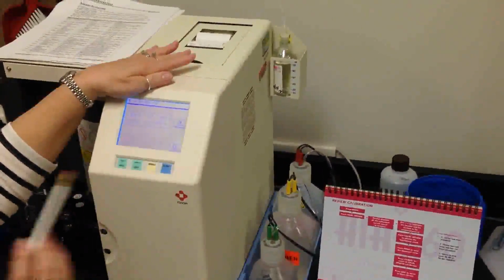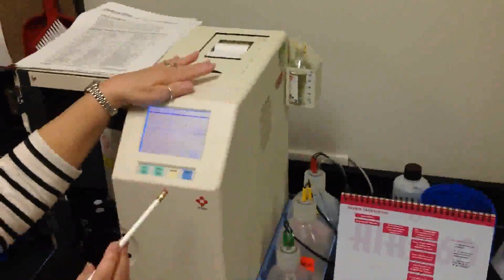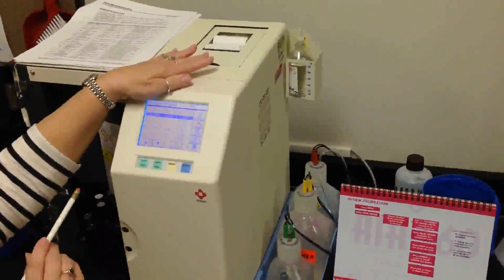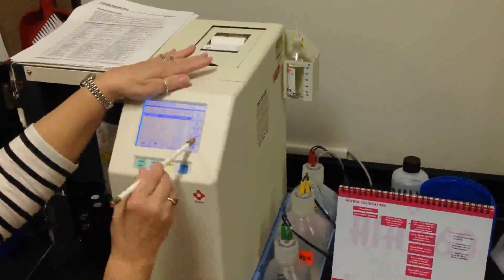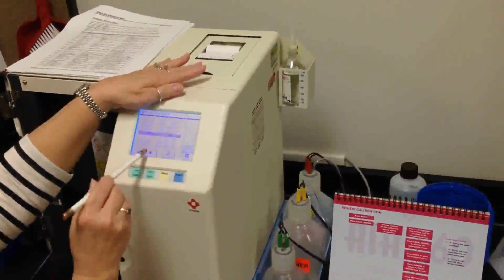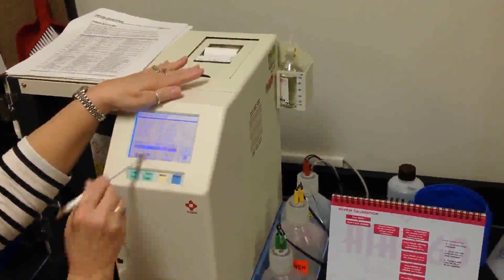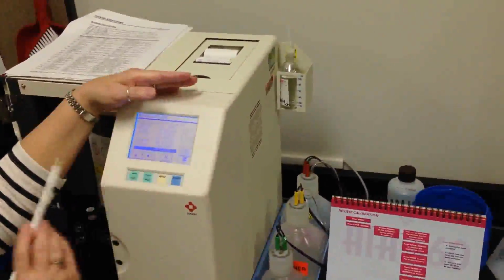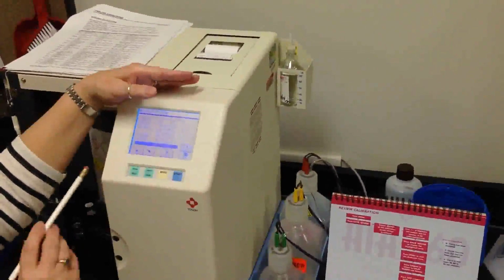And it always asks you a second time, is this what you want to do? Yes, I want to delete it. Calibration Review. Back to TSH. Now here is today's calibration. It's pending because it's awaiting me to accept it.